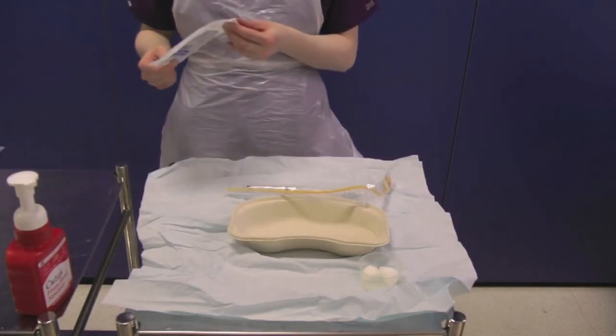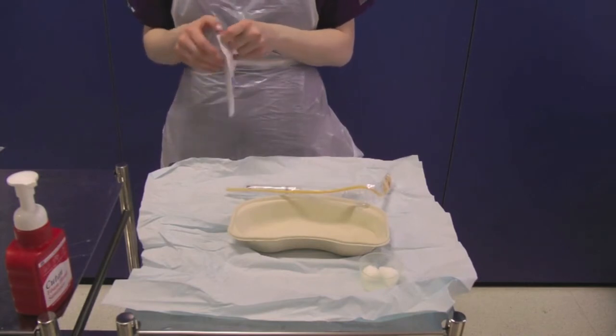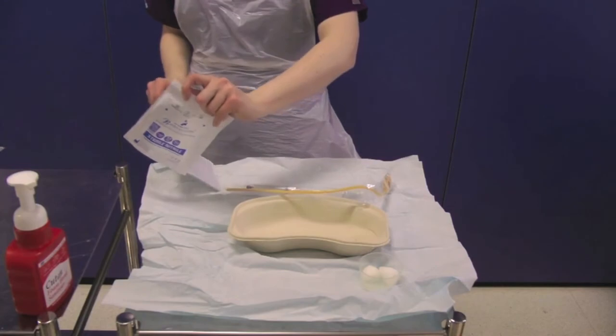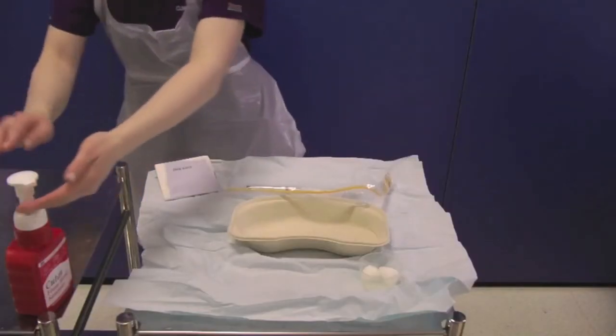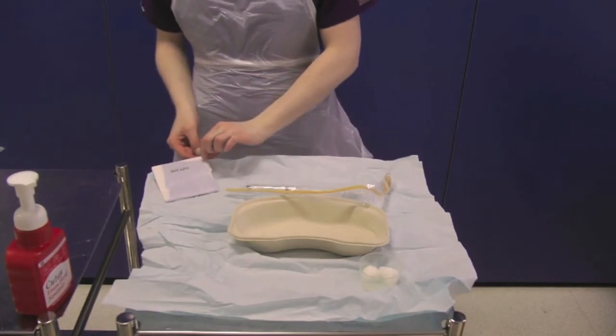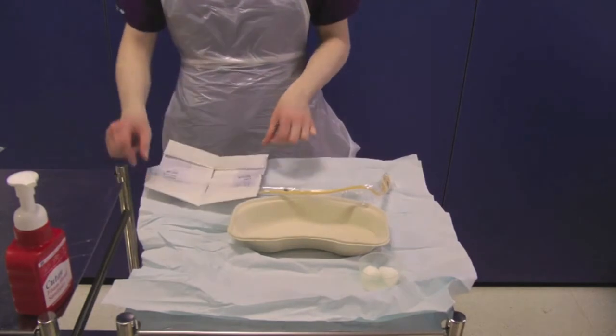Open the outer packaging of a pair of sterile gloves and drop the internal packet onto the sterile field. You must decontaminate your hands at this point. Carefully open the sterile wrapping, ensuring you do not touch the sterile field, and put the gloves on.